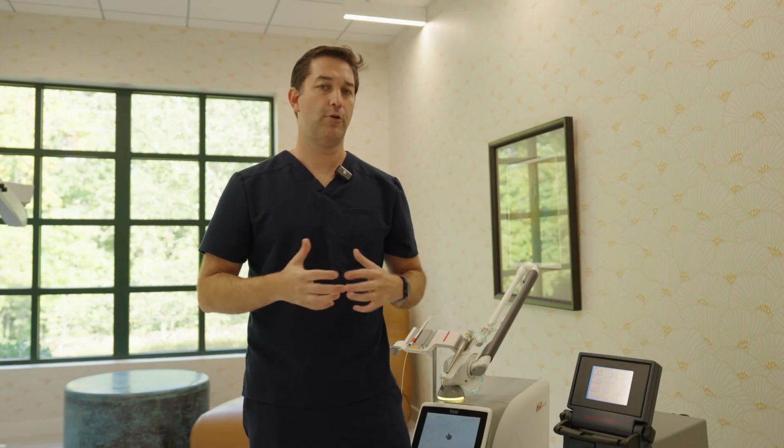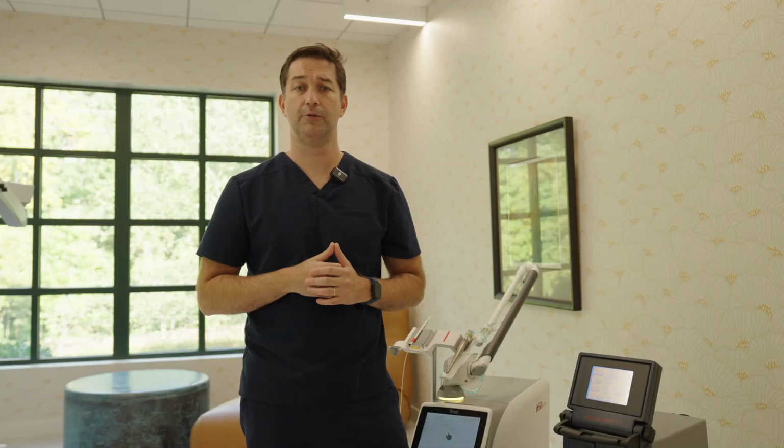The usual recovery time when you use a laser to treat periodontal disease is that most of the time, a day or two after the treatment, patients return to their normal routine. There's definitely a specific protocol that you need to tell patients to follow in terms of diet and how to clean their teeth for the first week after the treatment. But in general, they go back to their normal routine right after the procedure. They go back to work right after they have the procedure done.